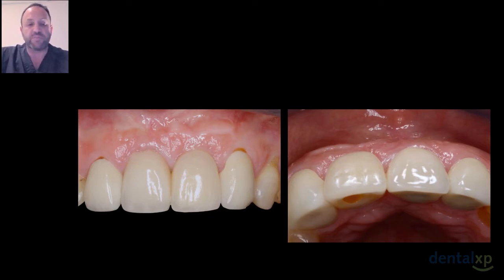You can see a wonderful papilla. If you look at the occlusal shot, there's very little, if any, collapse of the buccopalatal tissue. Now, I know a lot of you will turn around and say, "Yes, but Howard, that's all very well. The fact of the matter is that the reason the papilla are there is because I've got adjacent teeth."